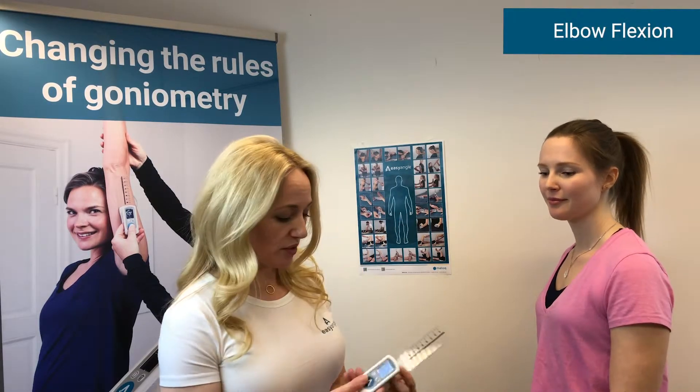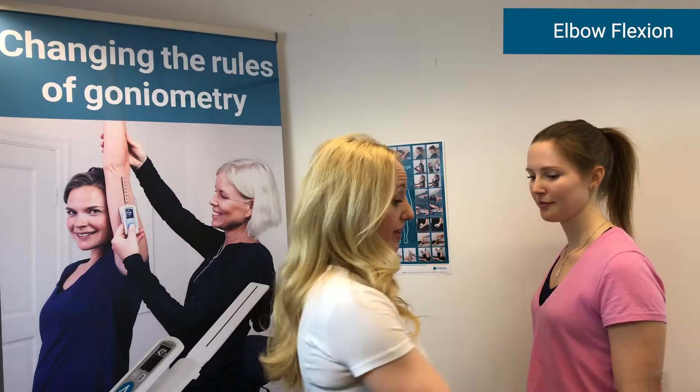In this measurement video we're going to demonstrate how to measure elbow flexion. We start by pressing the button and we get our blinking zeros, so we know that we're ready to set the plane of measurement.